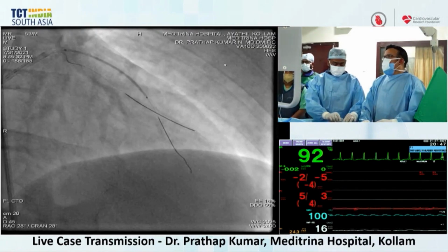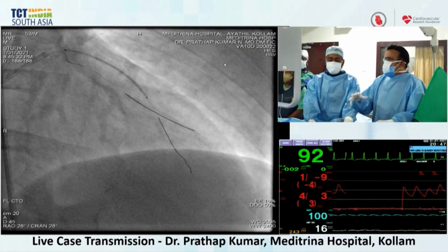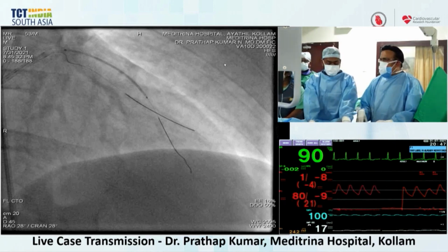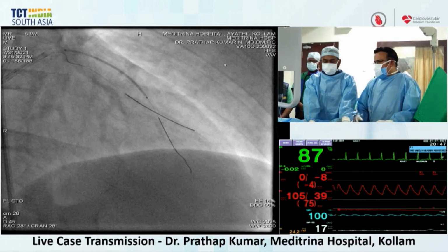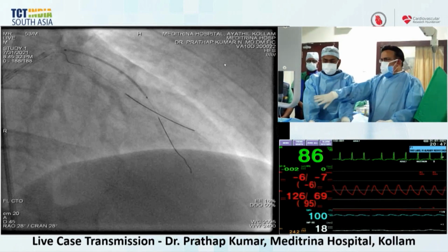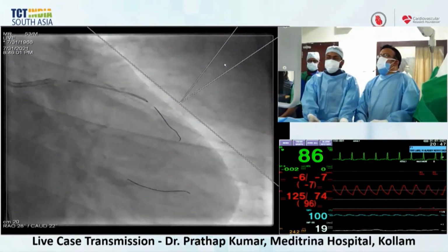Correct. That is one point, Dimitri, but another point is you may be pushing on some of the material in the proximal part, and that creates a slow flow distally. That is also one possibility we should think about in this case. Absolutely. So that's sort of where I was going as well with the flip to antegrade.